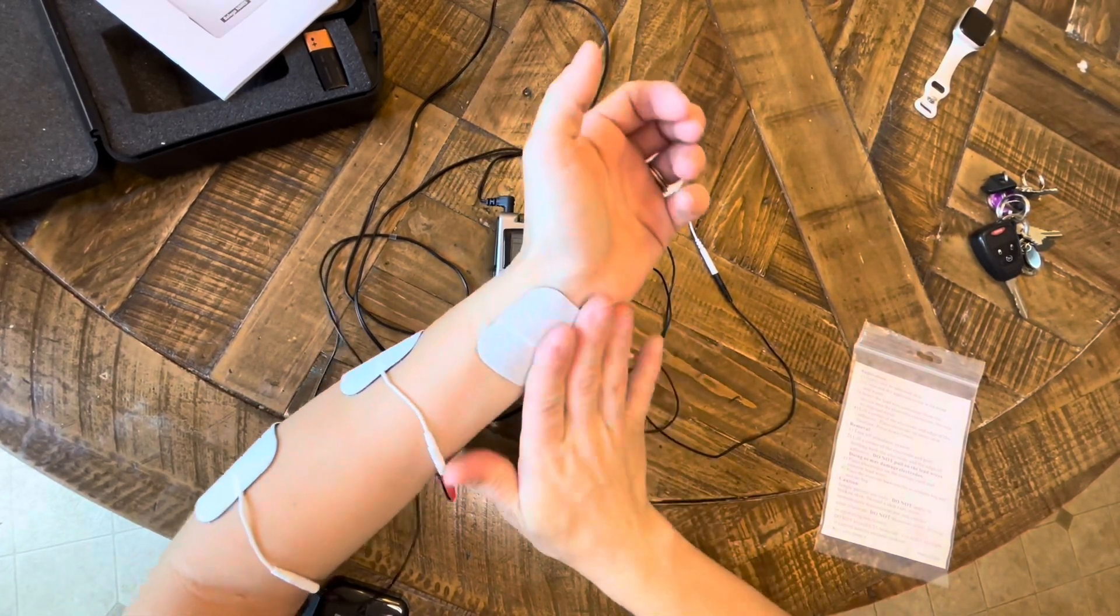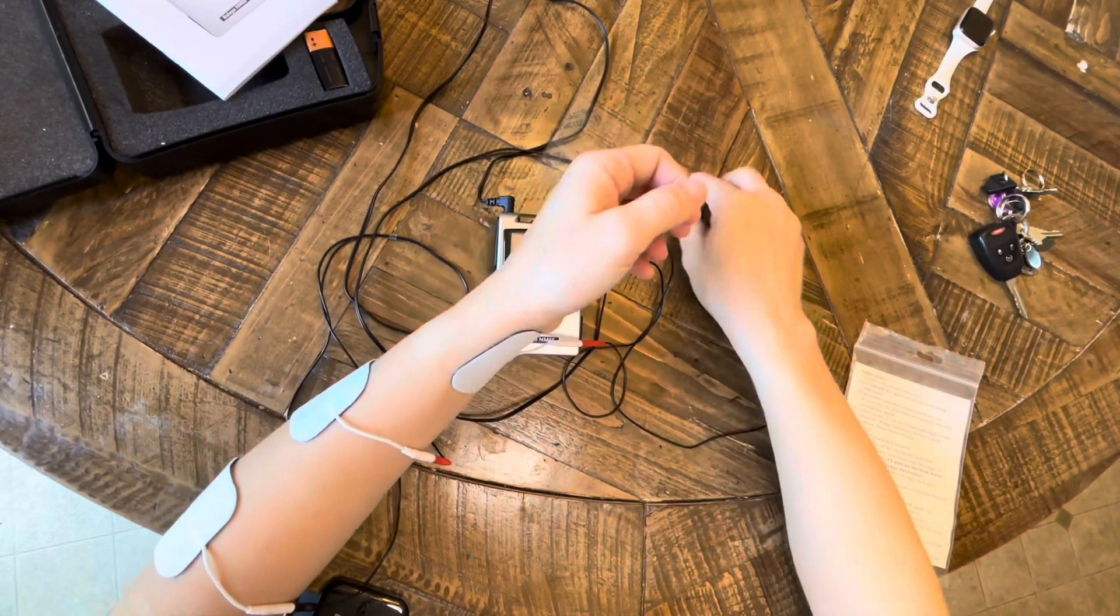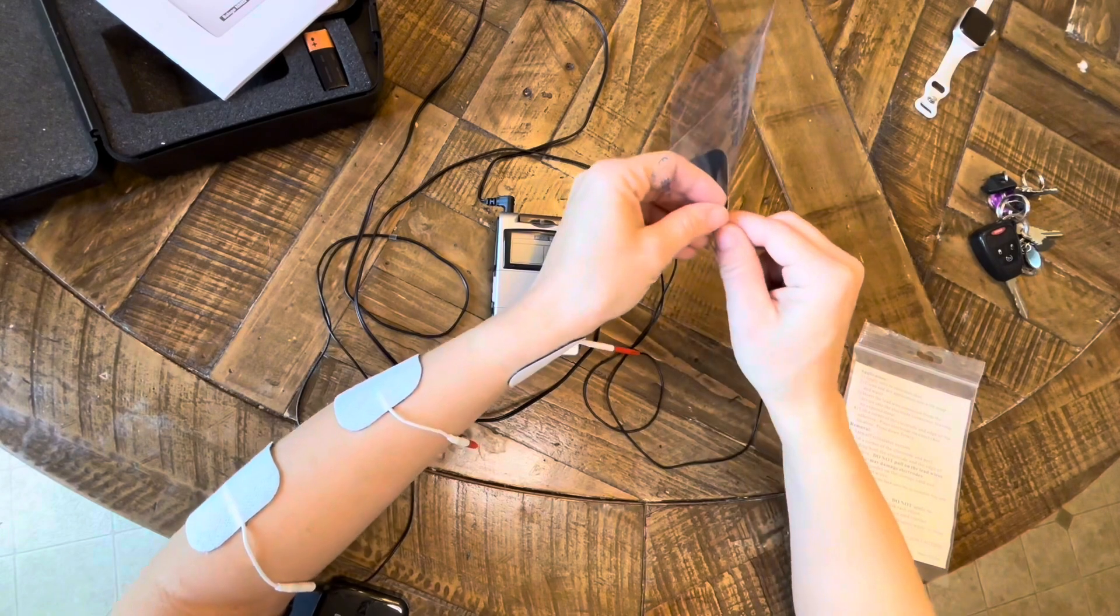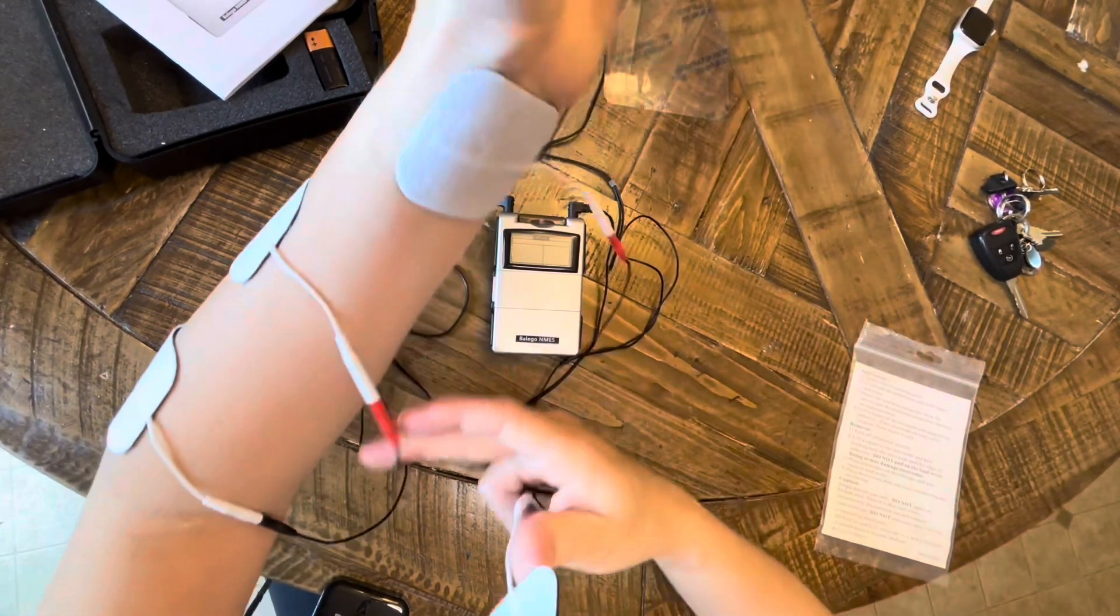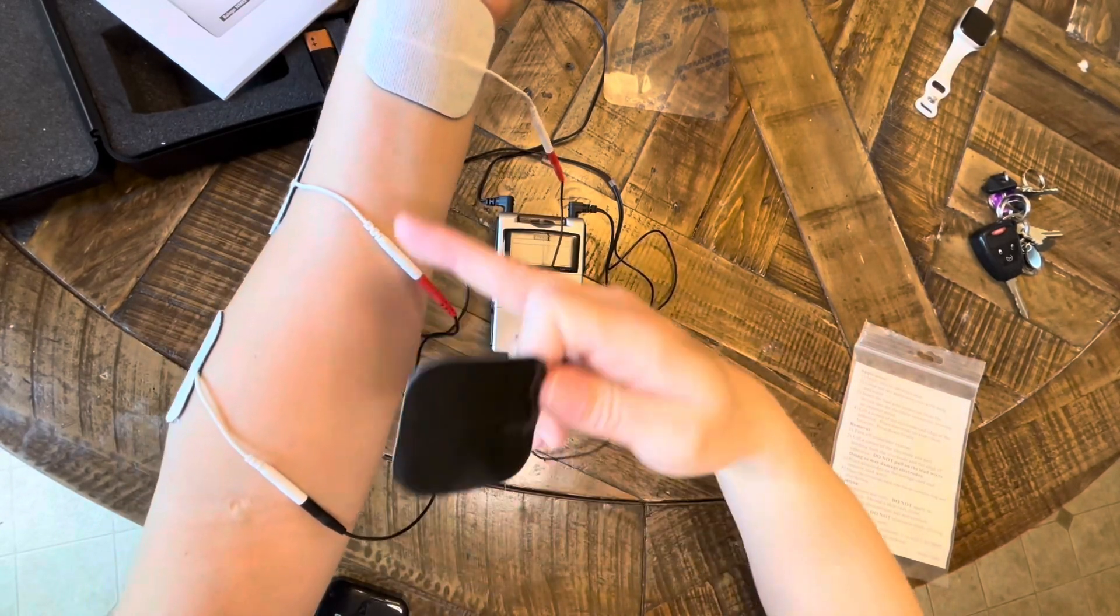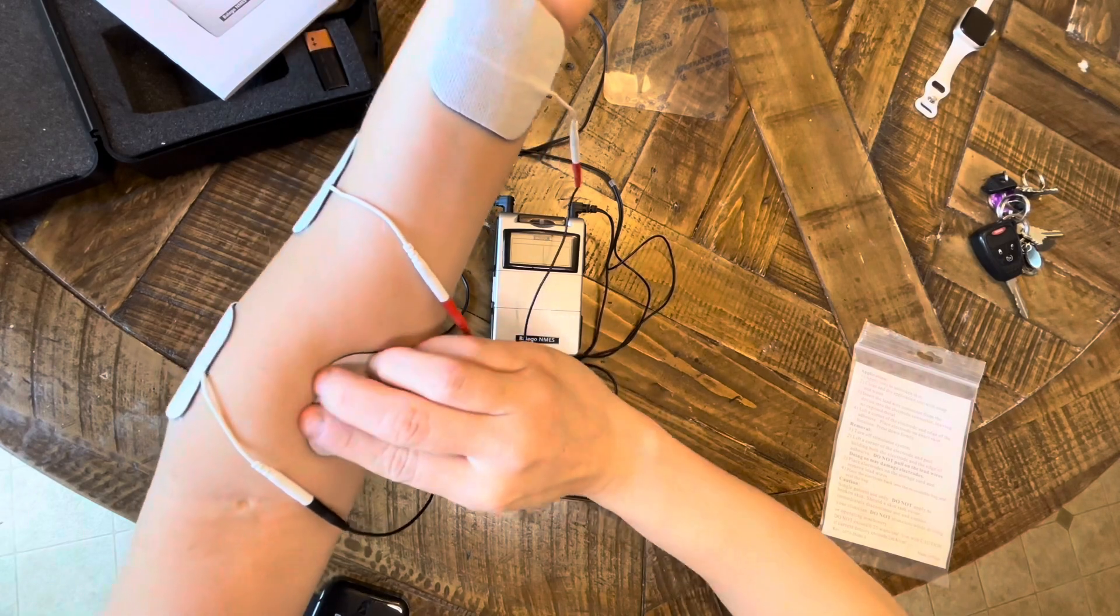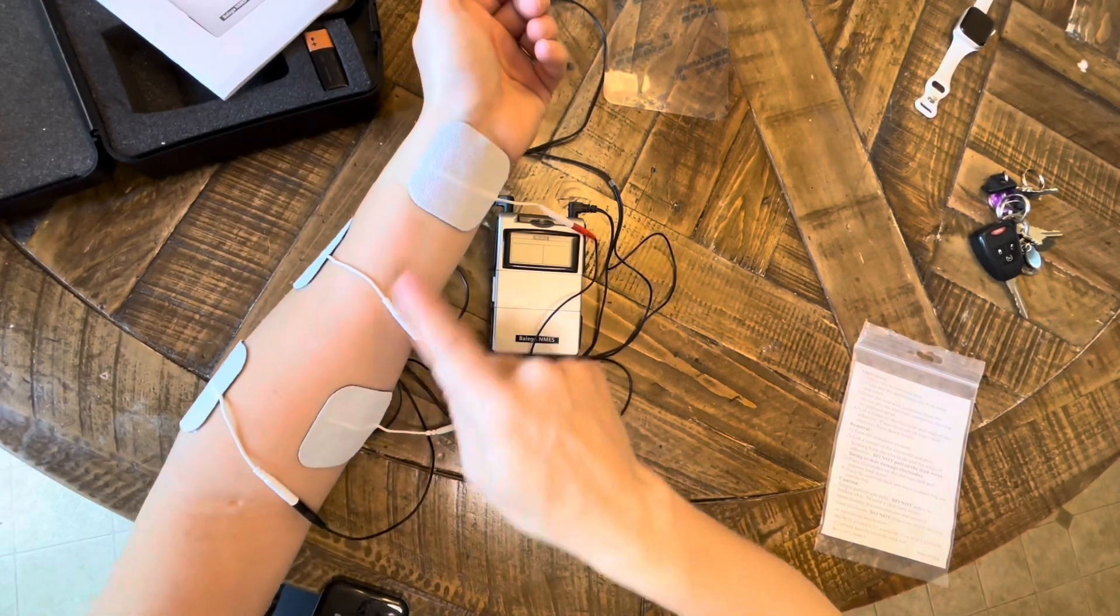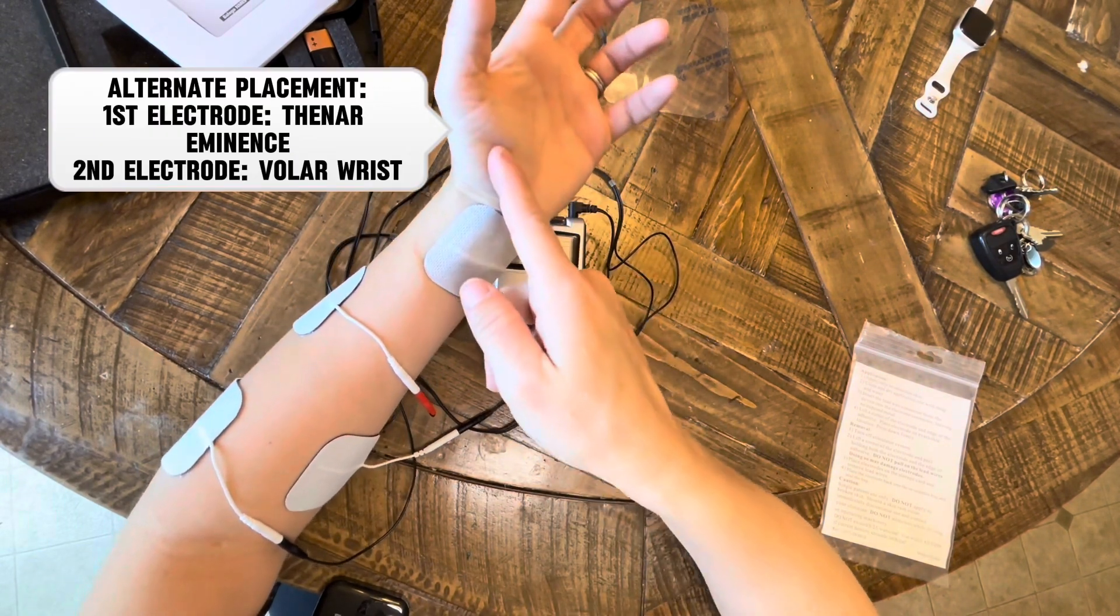So make sure when you're putting on your electrodes for flexion that one of them is really close to that wrist crease, and then the other electrode is pretty proximal to the origin point. We're trying to just target the muscle bellies of the finger flexors and not necessarily the muscle bellies that do just wrist movement.